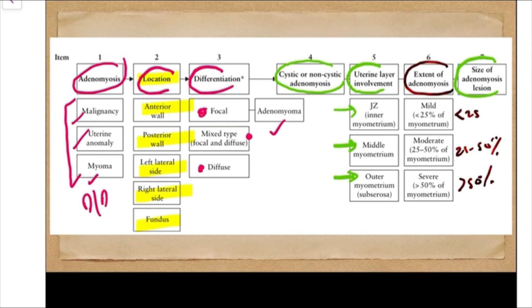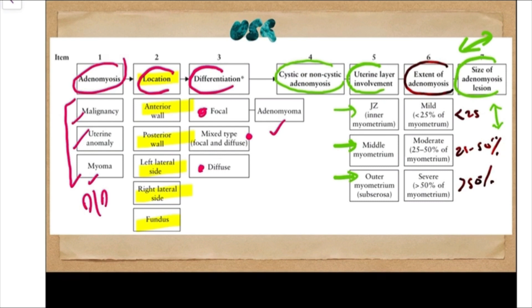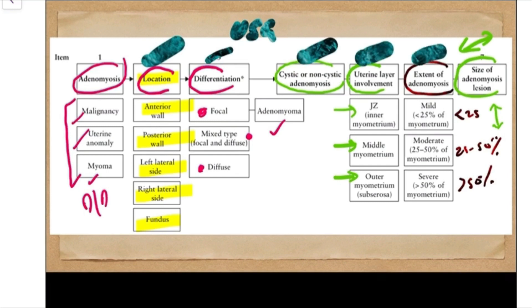For the size: if it is a focal lesion, give the largest diameter; if it is a diffuse lesion, give the maximum myometrial thickness. So to summarize the reporting: confirm adenomyosis, state the location, whether focal/diffuse/mixed, cystic or non-cystic, which layer of the uterus, the extent, and the size of the lesion.